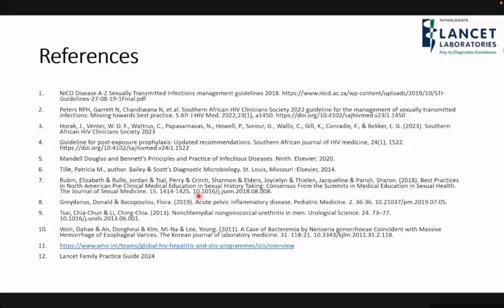With the PCR, because of the data that we already have, we know if the PCR is positive, we hardly ever see ceftriaxone resistant Neisseria, and in South Africa, I'm yet to see one. But we know in Southeast Asia, and America, they are seeing them. So if we get a PCR positive and a culture negative, at least there is data, and we can still treat these patients with ceftriaxone. We know we haven't seen this in South Africa. But if we all stop doing cultures, we're not going to be able to know whether we are getting a resistant Neisseria gonorrhea. So it's not redundant. We need cultures. That's how we do surveillance in the laboratory.